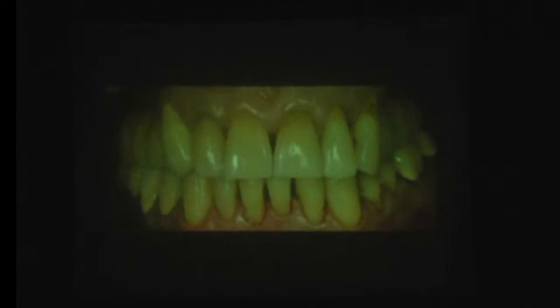So the case was like this, and then we placed the implants on the same day, and it's not about aesthetics, it's about function, but I've placed everything in a good way and finished this way. The initial point and the final point. Normally, with pneumatized sinuses, it was almost impossible for a dentist to place the implants bilaterally. So, if accuracy matters, sure.